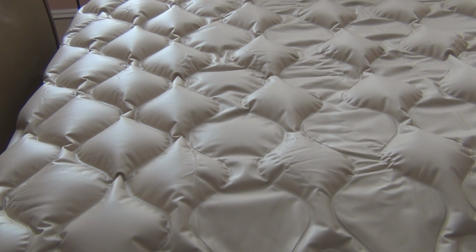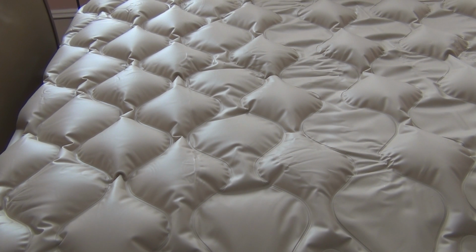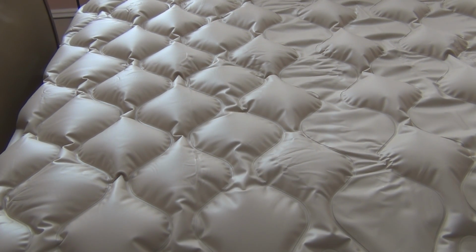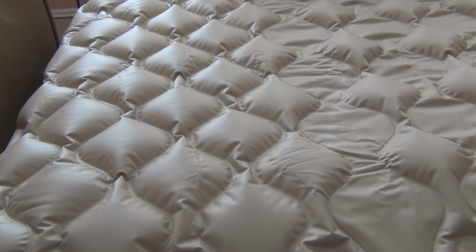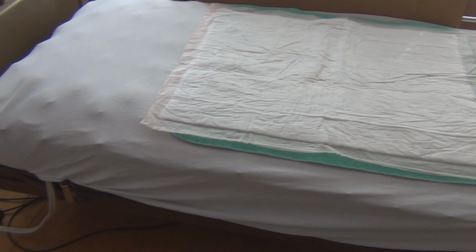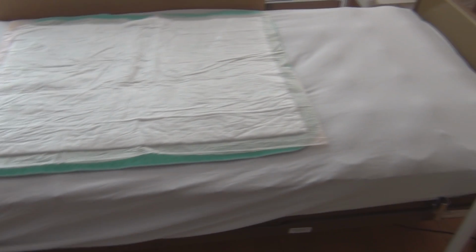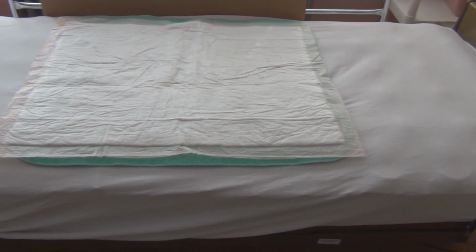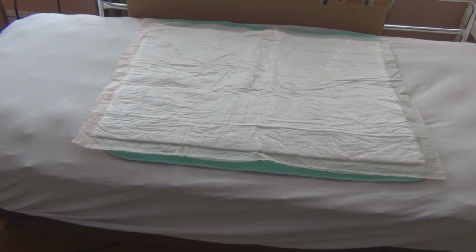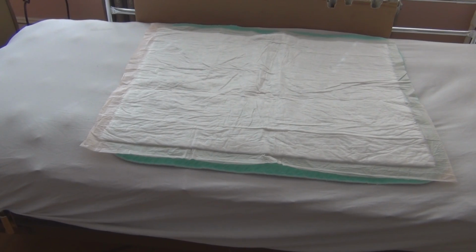And the pumps really aren't that expensive either. They're around $50. You can get a whole system with the mattress and the pump for under $100, $80, $90. So that's with the sheet on, or the mattress cover. So I just wanted to share my story. That's my experience with the alternating pressure pads.